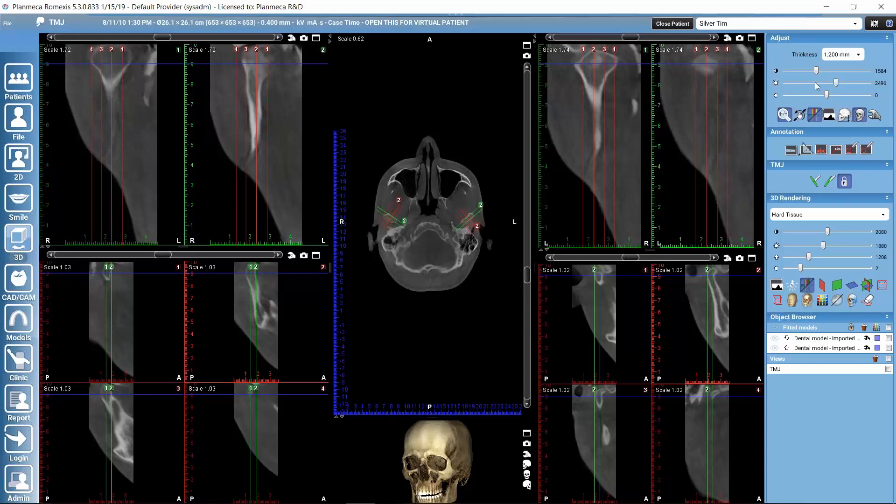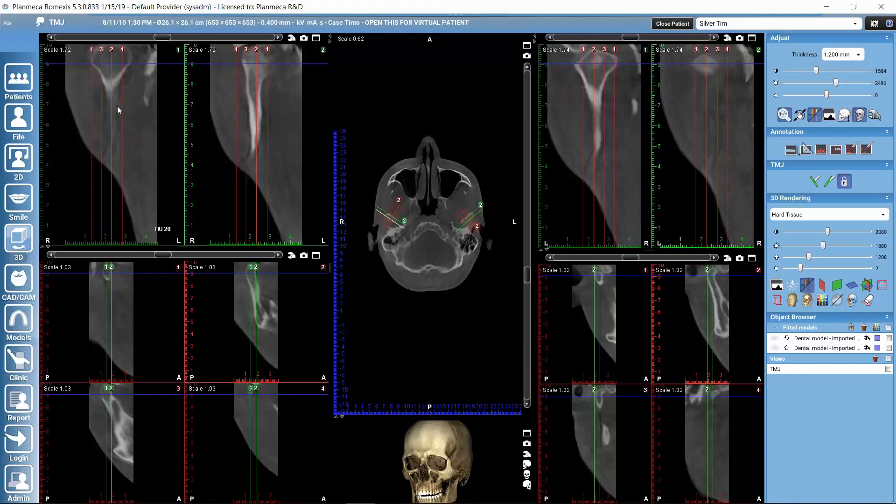Naturally, we can also adjust the grayscale values by using these sliders for contrast brightness and sharpness. Or we could use the histogram if we would like to adjust how these slice views look like.